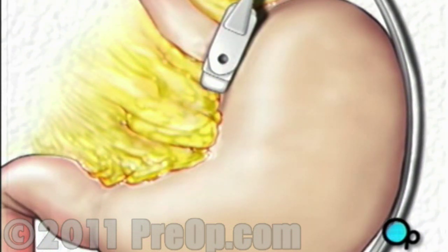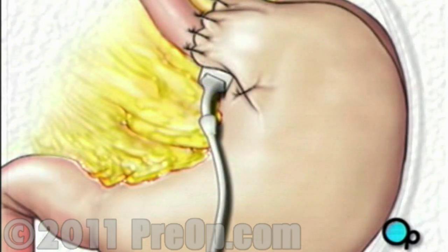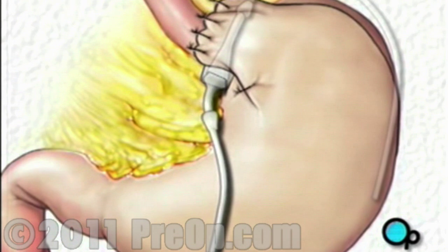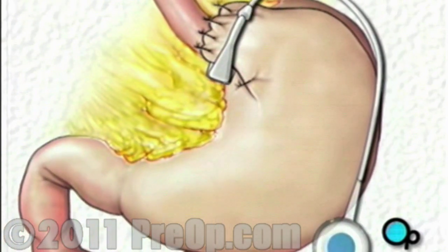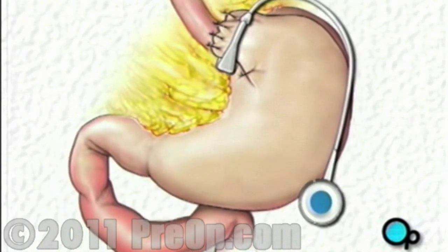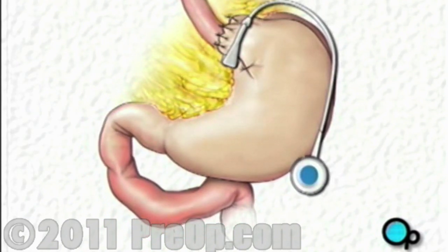To keep the band in place, a portion of the stomach will be pulled over the band and secured with four or five stitches. The remaining portion of the tube, used to pass saline into the band, will be trimmed and a special valve will be attached. The valve will be sutured into place just below the skin in the upper left area of the abdomen. This valve will allow your doctor to adjust the tightness of the band and control the size of the opening into your stomach.